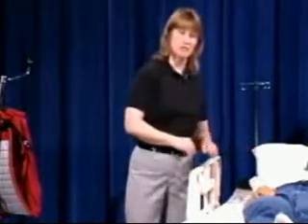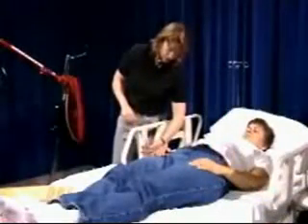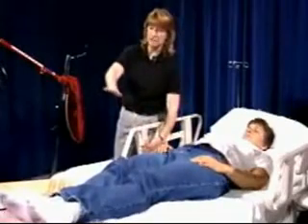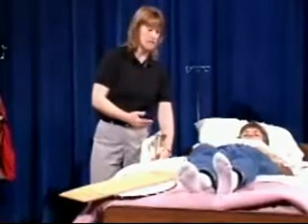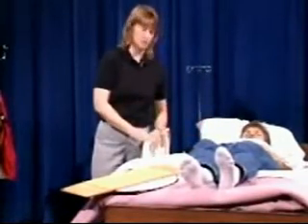You can also use the foot side of the bed and raise that up just to have gravity help you if you're trying to move the patient up in bed. If they need to be repositioned or shifted up in bed, leave the head of the bed down, raise the foot of the bed up, and that way gravity is helping, and you can get them sometimes to help too by pushing, and it's just an easier transfer and an easier move.